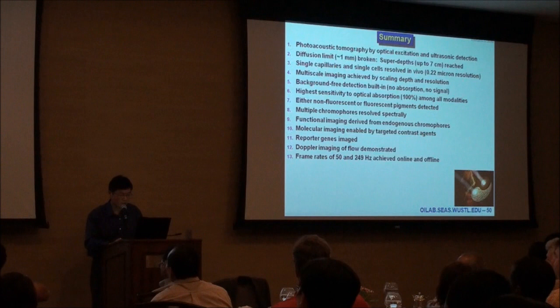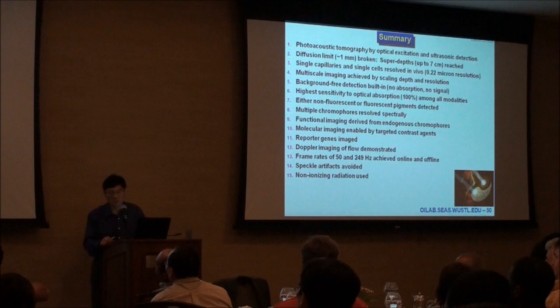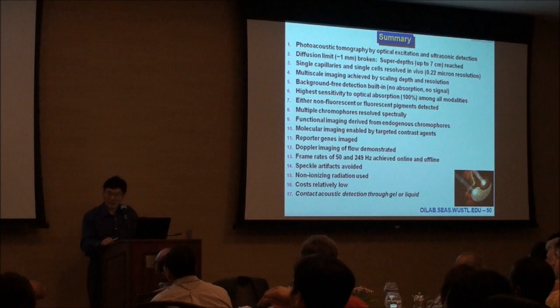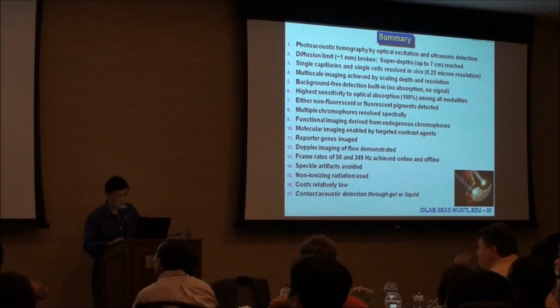There are no speckle artifacts, very different from OCT images or from ultrasound images. Only non-ionizing radiation is used. It's very safe to use. The systems are relatively low cost. However, we do require contact measurements, so this is different from OCT. We usually use gel or liquid for coupling purposes.